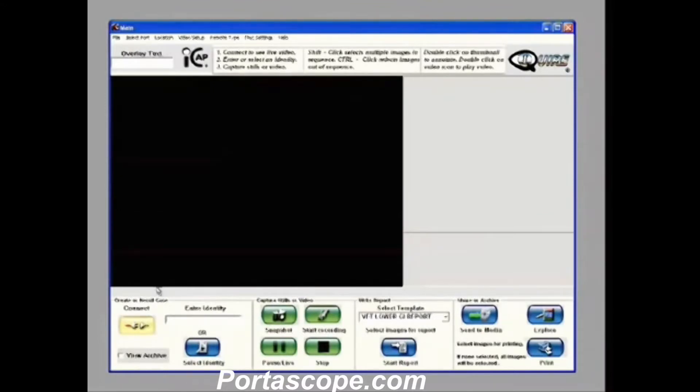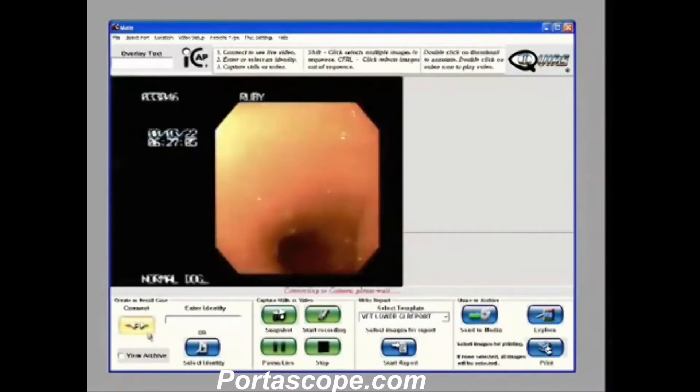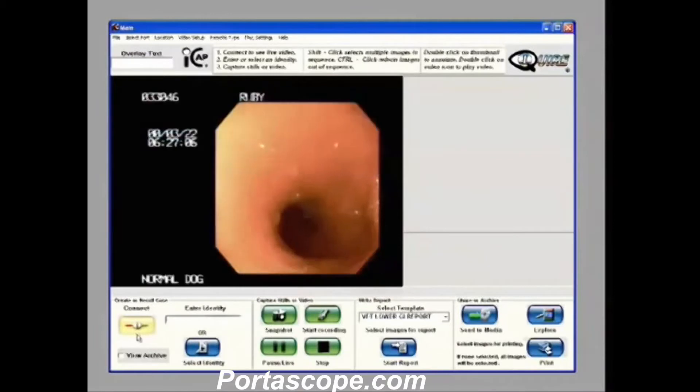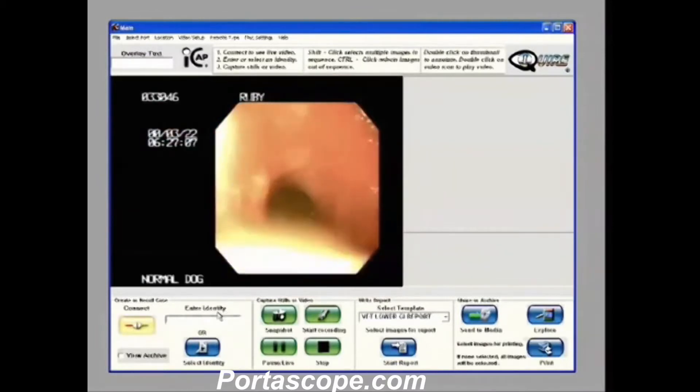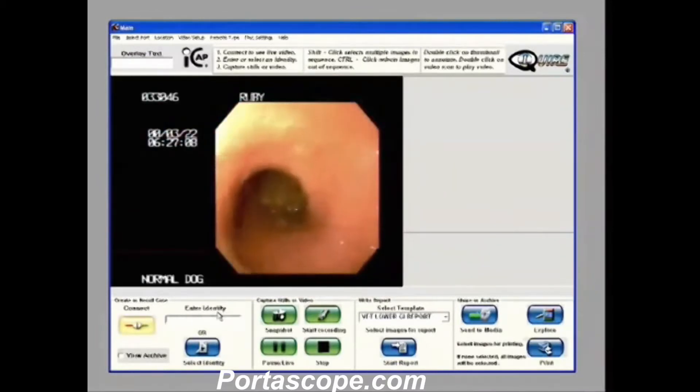Number 1 is connect to the live video. Simply hit the connect button and you'll see the icon connects and our live video is shown in the preview window.